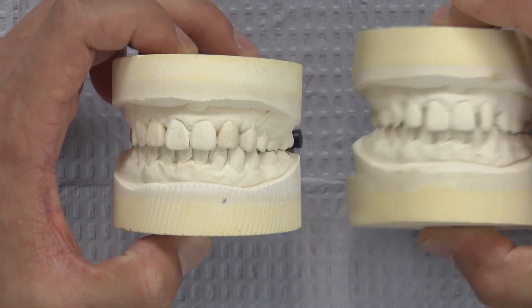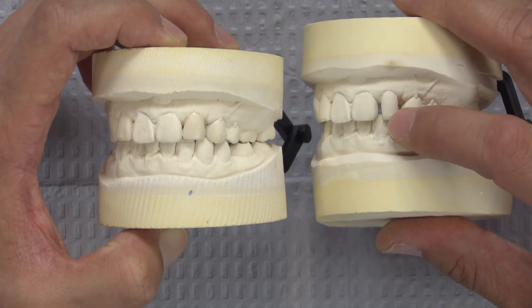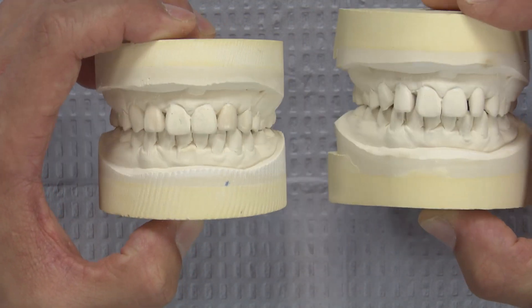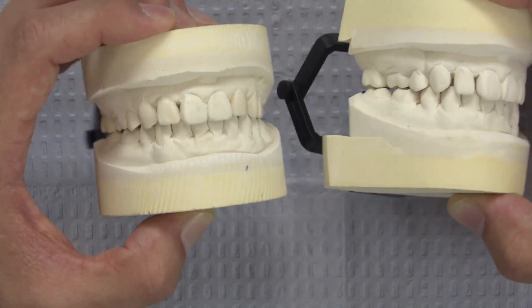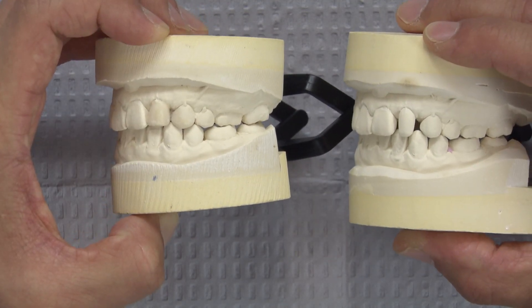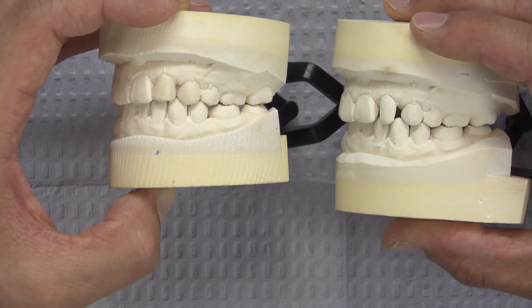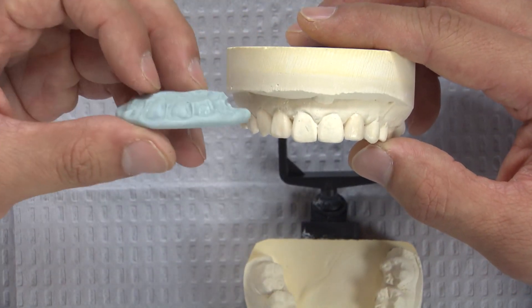The first thing I did was reduce the length of number 10 — the original length is just about even with the central, so we do want to shorten that a little bit for a better aesthetic result. I did apply wax to the mesial and distal surfaces of both 7 and 10. To avoid the laterals from appearing too wide, I also applied wax to the mesial portions of the canines, number 6. And since number 11 is missing and number 12 is occupying that space, the maxillary left canine, we're going to attempt to mimic a left canine by extending it. We lengthen it a little bit and bring that mesial surface over. From the wax-up, to transfer what I hope to achieve intraorally, I fabricate a putty matrix.